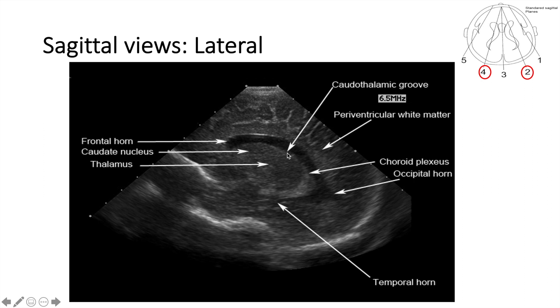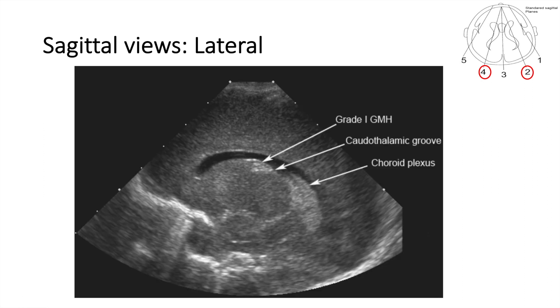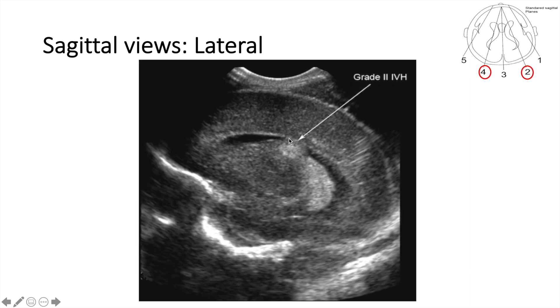This groove here is called the caudothalamic groove, which is a very fragile area. This is how grade one IVH looks — it starts in the caudothalamic groove. You can see a little bit of bright blood that does not extend inside the ventricle, and this is what we call grade one IVH. When that clot is a little bit bigger and extending inside the ventricle, this is grade two IVH.